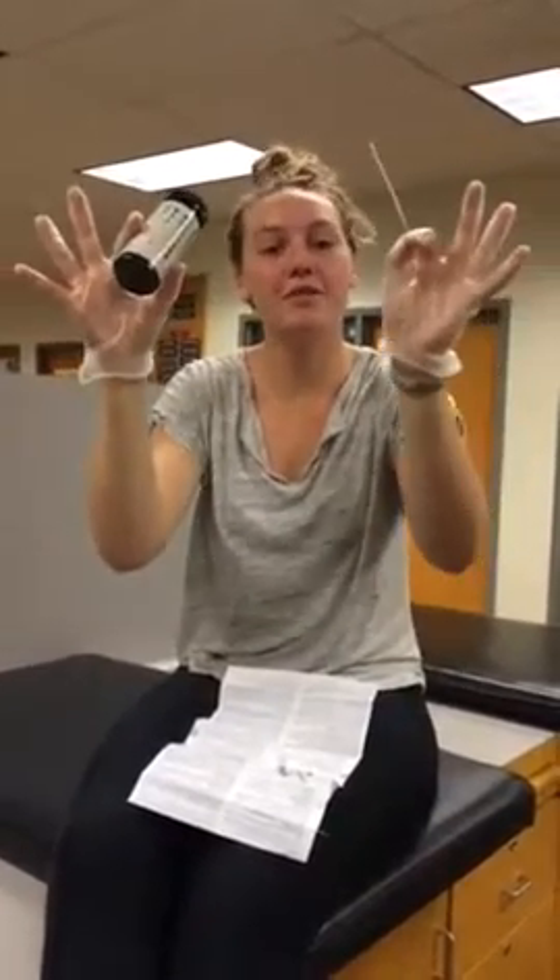First, make sure you've got your gloves on. Next, check the expiration date on the bottle and make sure that it's not March of 2015. If it is, you should get a new bottle in your athletic training room.